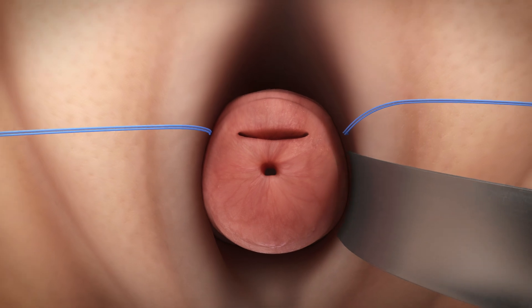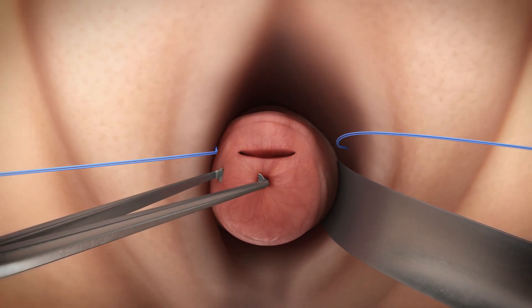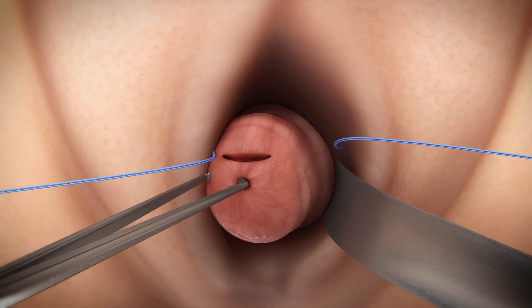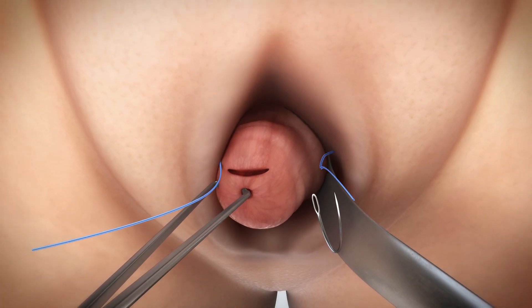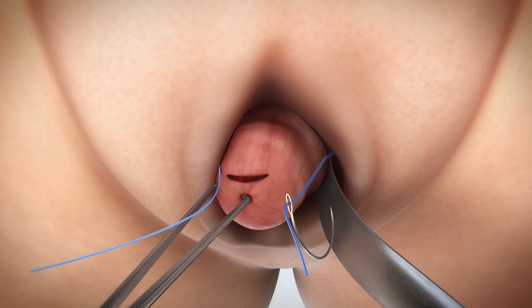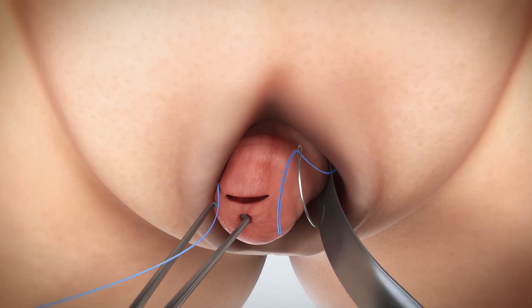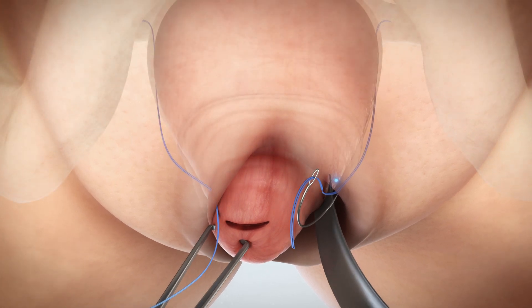A retractor, such as a Deaver or Breisky, will be used to widen the vaginal wall and identify the suture from the original anchor placement. Using a 1- or 2-inch free mayo needle, thread a suture tail through the needle to ultimately pass behind the vaginal wall and through the cervical stroma. The surgeon will use the original puncture or piercing from initial placement of the anchor — that small target is the access point.